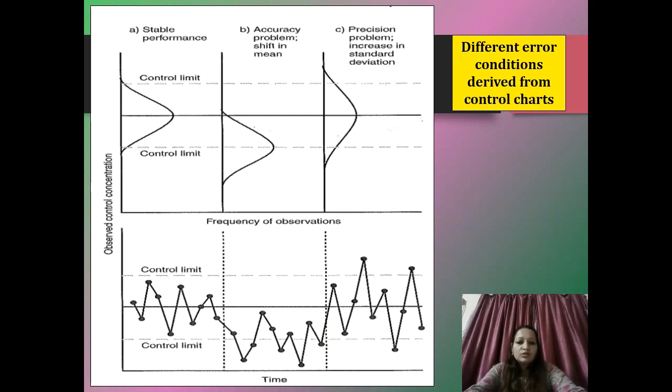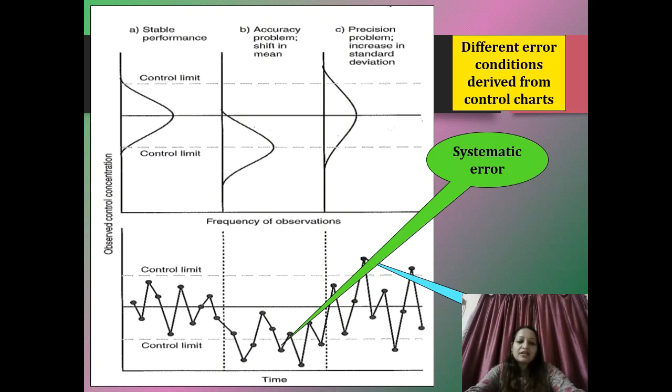So, coming to the different types of error once more, there can be two types of error which can be derived from the run of the quality control materials. In the Levy-Jennings chart, one can be an error in precision, that is a random error, which occurs, as the name suggests, utterly randomly, at a single time point. And a systematic error is an error which has occurred due to constant deviation of values one after another from the mean value, so that the values after every run are deviating more and more away from the mean. This deviation of a value away from the mean is what is known as bias, what is known as inaccuracy, and this constitutes a systematic error.